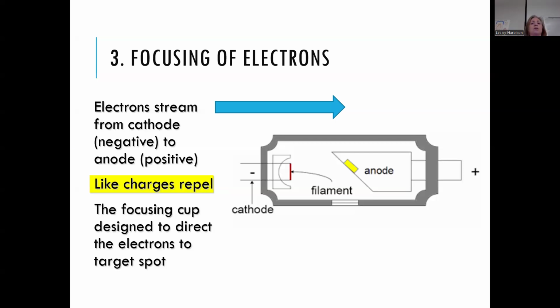And in the picture, the yellow piece, not the part that's highlighted that says like charges repel, but the little yellow rectangle, that is the tungsten target, just to reiterate that. It's embedded in the copper stem, and that's the tungsten target. That's where all the electrons are the ones that we want to fly over and generate radiation.